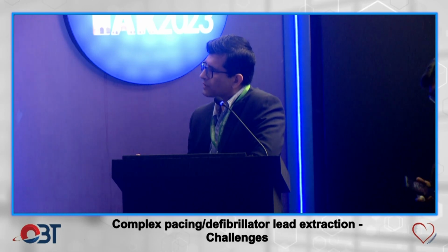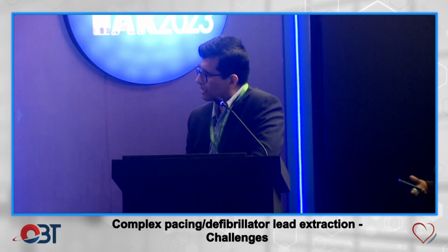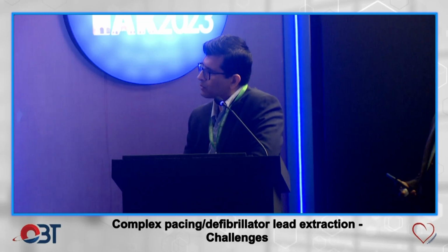Like us, we have the console which is most of the time with us, but our interventional cardiology colleagues use the same console, but of course a different laser. There's the ELCA catheter for that, and they use that catheter for this purpose.